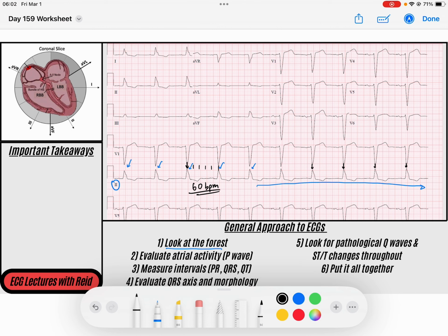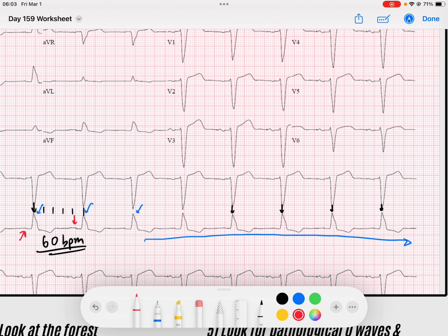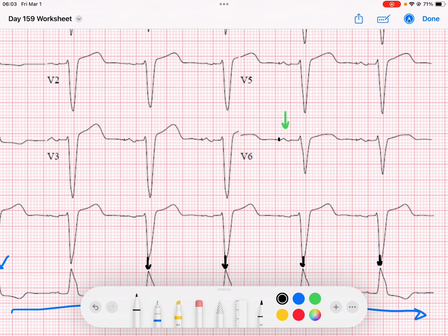There's no variation. And why do I bring this up? I wonder if this person has a pacemaker, right? Like, why is this beat so perfect? Well, I look in front and I see some atrial activity in front of my QRS complexes. What's interesting about that atrial activity, though, is if you look over at the lateral leads, what you'll see is that in front of those P waves, I've got this little itty bitty spike. Look at that. Spike. That's a pacing spike.